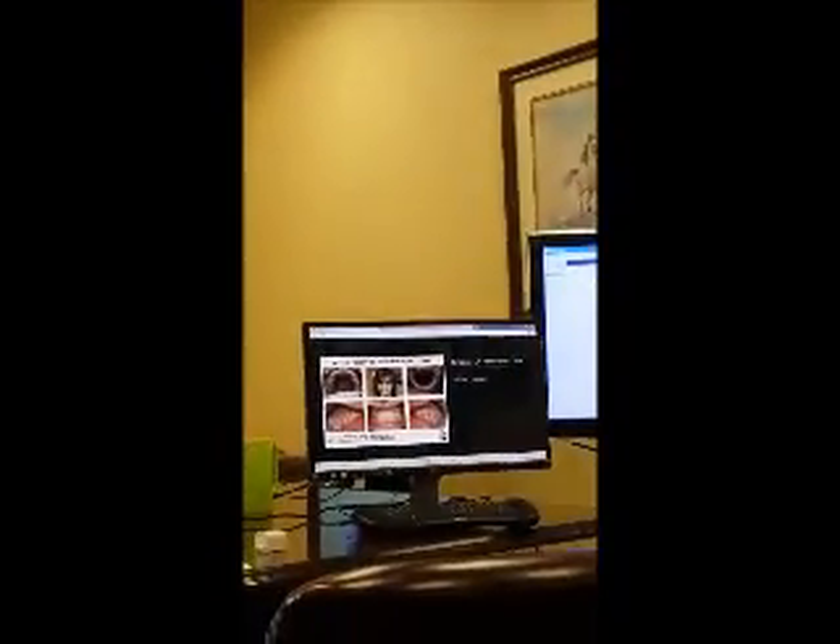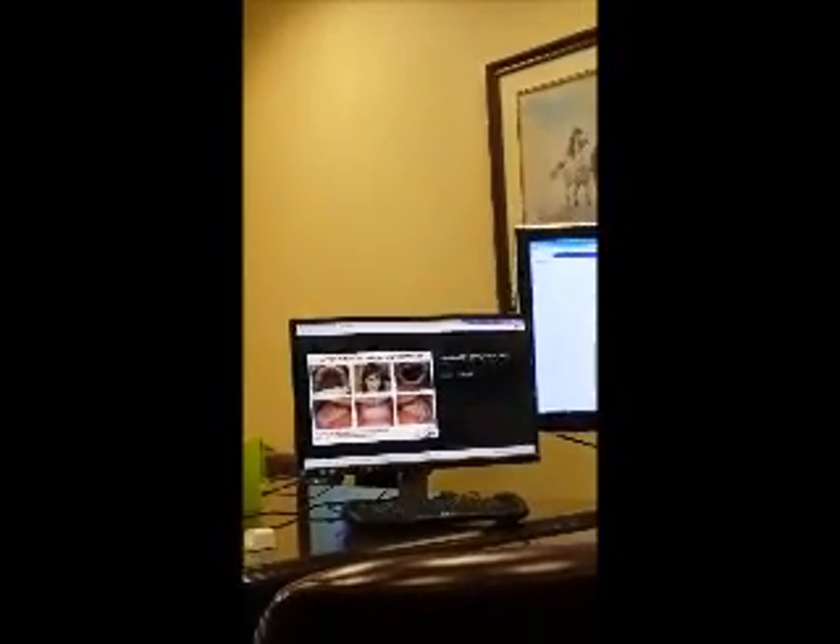The face, a smile shot, and then occlusal shots on the right and left. The first thing I do is set the focus here, and I come out to about the patient's knees. Notice how I'm holding the camera so I can get a nice identification shot there.